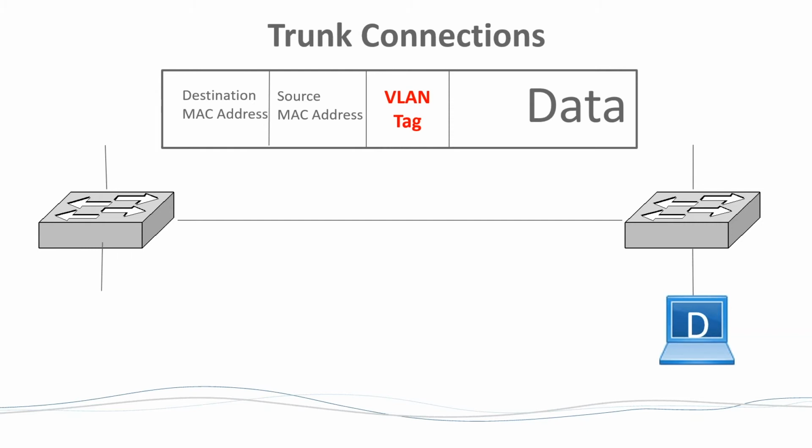So someone might say to you, because I'm on these conversations, it wasn't working right, and then the network guy comes back on, and they're like, oh yeah, the VLAN wasn't on the trunk. I don't know if you guys ever heard that before, but that's what they'll say. You're like, what? The VLAN isn't on the trunk? Now we know what that means, right? That trunk line right there wasn't authorized to deliver that VLAN out. Or they'll say, yeah, it didn't work because I didn't have the VLAN on the switch, or I didn't have the port in the VLAN, right? So the VLAN has to be on the trunk, on the switch, and the port has to be a member in the VLAN. Okay. Any more questions on that?